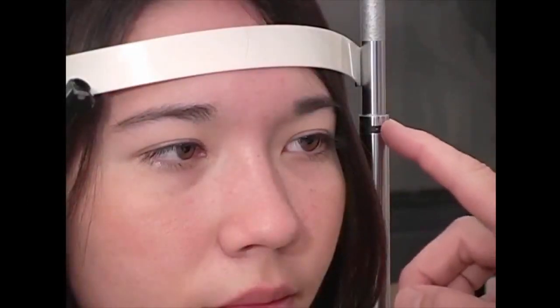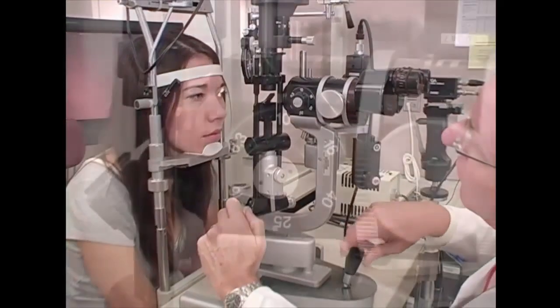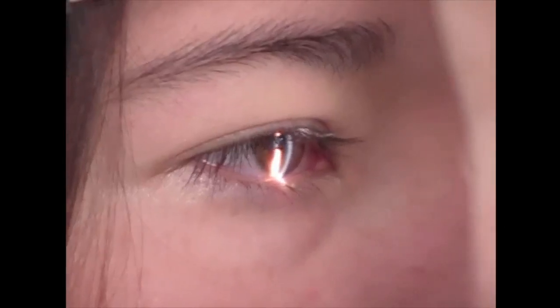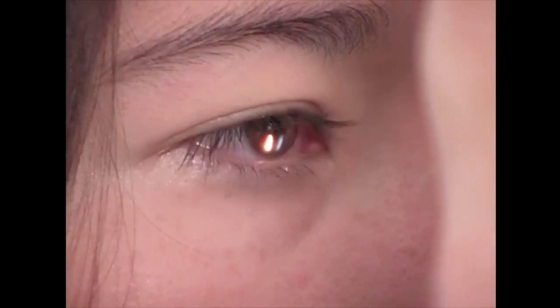So this is the canthal mark on the slit lamp that tells me the patient's lined up and centered so that I have maximum excursion. I'm going to do the exam mostly at 10 or 16x. I don't need to magnify things too much. And I use a short beam of light.